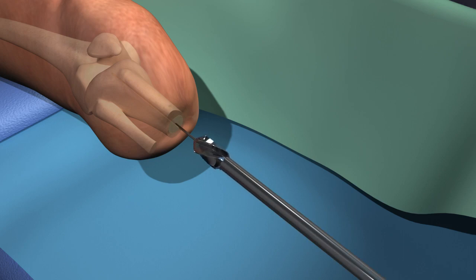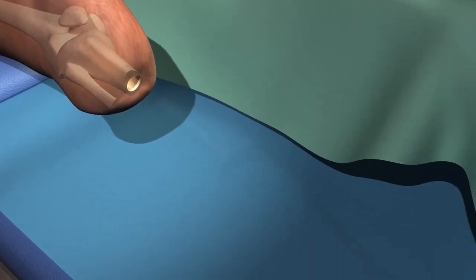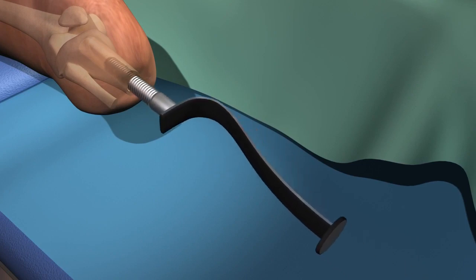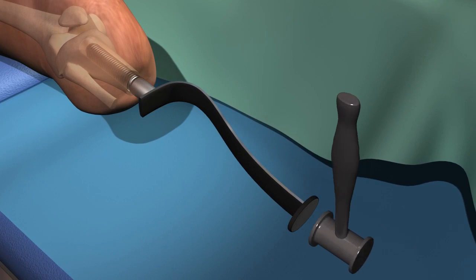The canal is prepared first with a drill and then with brooches. The implant is optimally sized so that there is immediate stability and fit.